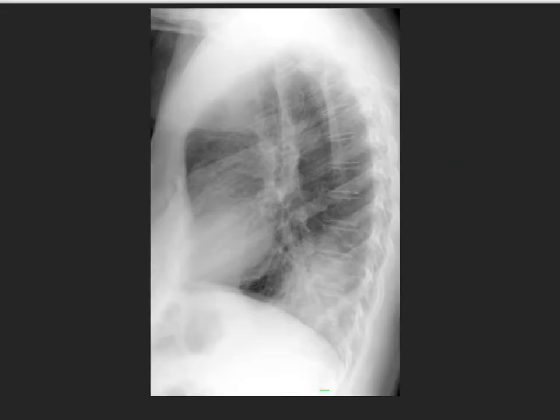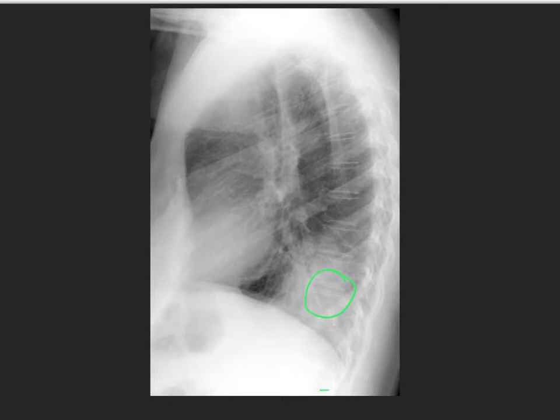So why do we care? On occasions, such as when patients have a spine sign from a lower lobe pneumonia that we can't see on the frontal chest X-ray, our only indication is something like this on the lateral chest X-ray. By identifying which diaphragm is being silhouetted out, we'll be able to tell what sign it is.